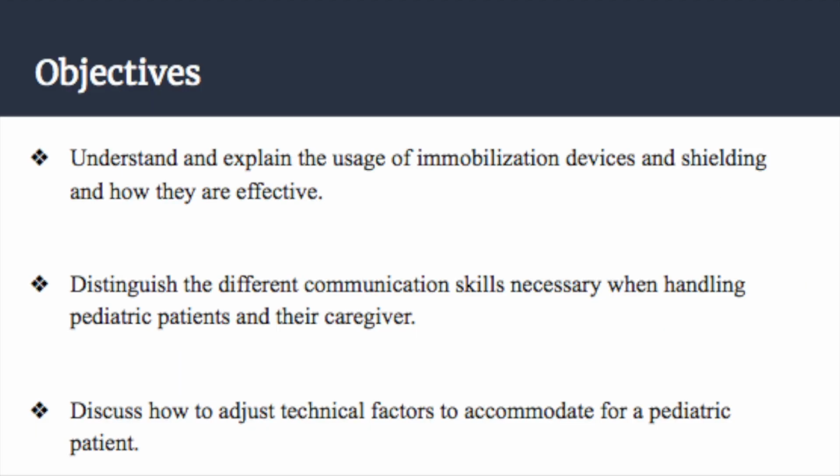By the end of this video, you'll be able to understand and explain the usage of immobilization devices and how they are effective, recognize appropriate technical factors used in pediatric departments, distinguish the different communication skills necessary when handling pediatric patients and their caregiver, and what to consider for common pediatric procedures.